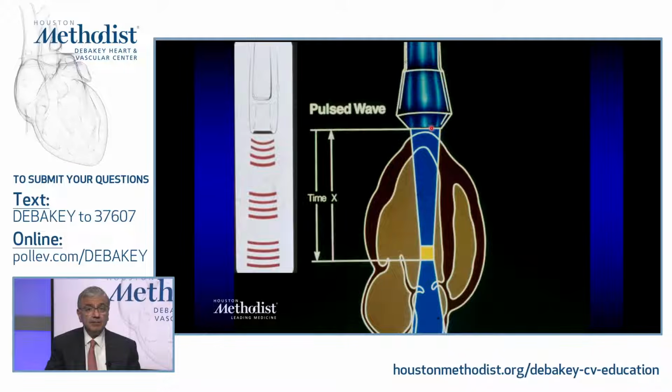Now, interestingly enough, you don't hear a 3.5 megahertz because it's in the inaudible ultrasound range, but the frequency shift, because of the velocities of red cells, is usually in the audible range. They are in kilohertz, could be 3, 4, 5 kilohertz or so, and that's why you hear these changes, right?